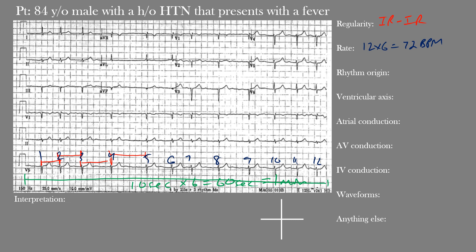For rhythm origin, we have narrow QRS complexes here, so the rhythm must be supraventricular in origin. However, you can't really make out any P waves, so it's certainly not sinus rhythm — it must be coming from somewhere within the atria or AV junction. Looking at lead I, lead II, and AVR, there are no clearly defined P waves before our QRS complexes and no inverted P waves in AVR to suggest sinus rhythm. Our origin is from the atria or AV junction, not ventricular, because our QRS complexes appear normal.